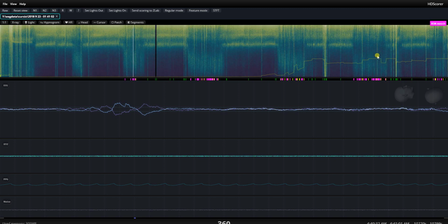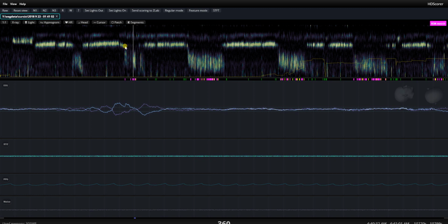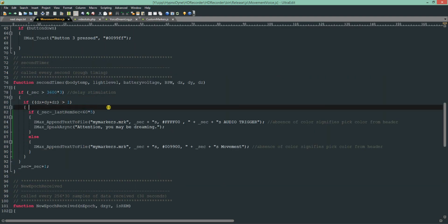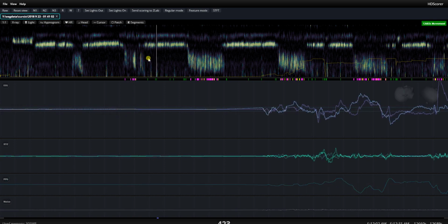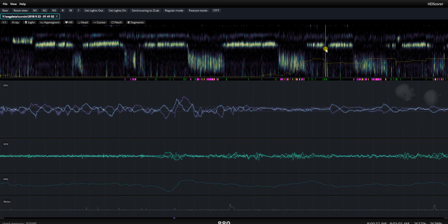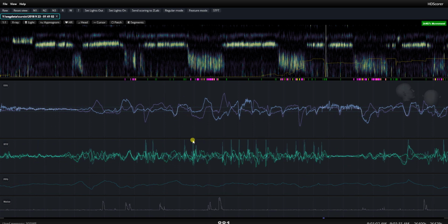The first thing you should pay attention to, of course, is the sheer and utter accuracy of this REM detection. There are no false positives whatsoever, and a substantial portion of actual REM sleep is tagged in purple. But now, on top of that, what I'm doing is analyzing the movement on a second-by-second basis, and that's shown here in green. So you see here, they got tagged as a movement because of this movement there. If we go towards the middle of this sleep cycle, we've got this movement right here, and here we got all this movement, right?